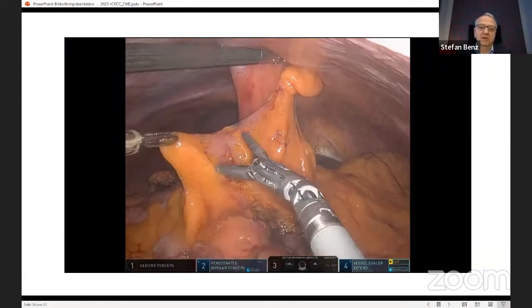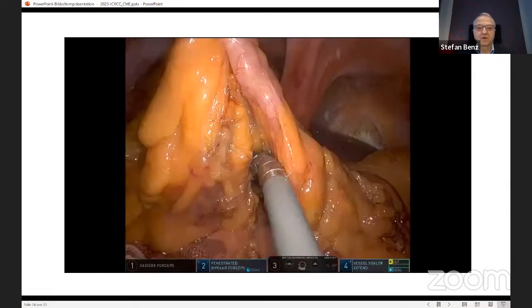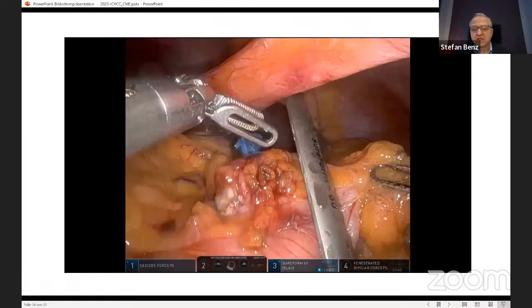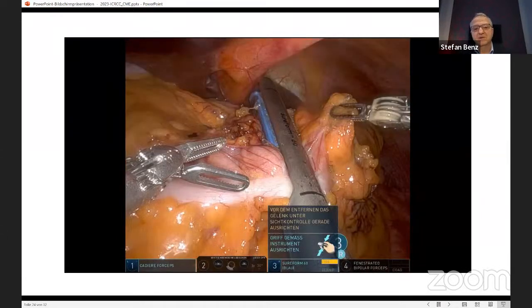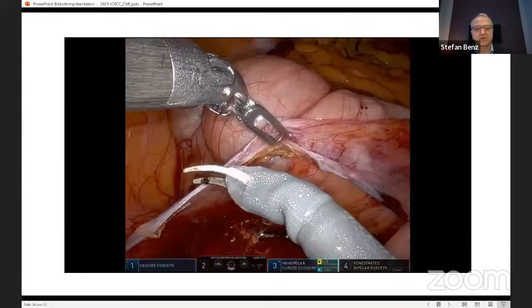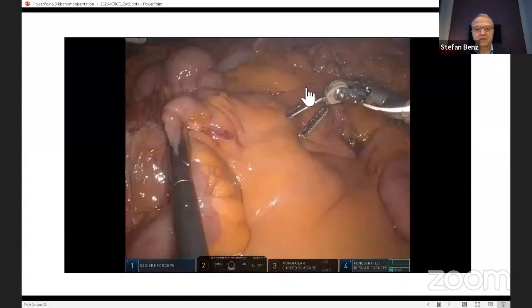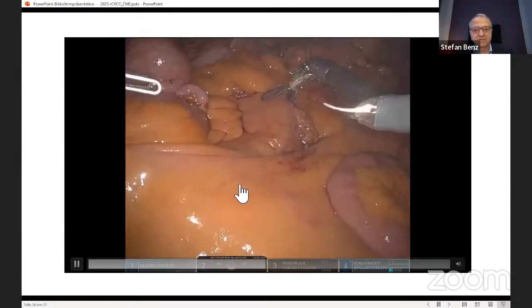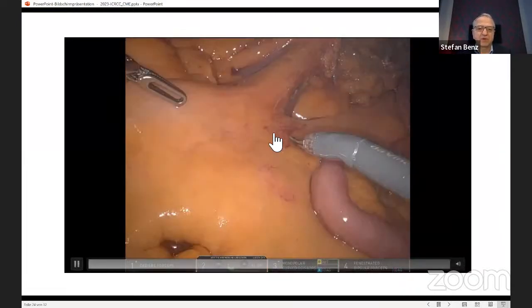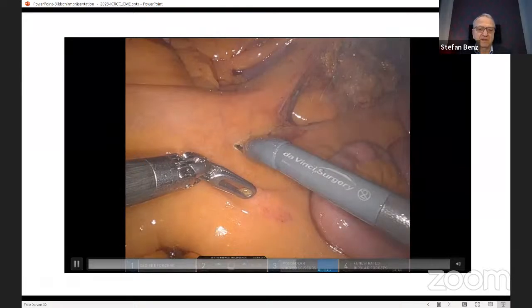And then we do an intracorporeal anastomosis, so we have to dissect the mesocolon, divide the colon with a stapler, which takes quite a bit of time, and it's not so easy to dissect the mesocolon without injuring the bowel, because normally you can't really stretch it as well as you like. Then we divide the mesoileum. Don't want to injure the specimen, of course. And it's very important to stay away from the ileocolics when you do this. Otherwise, you sort of destroy the nice dissection you've just done.